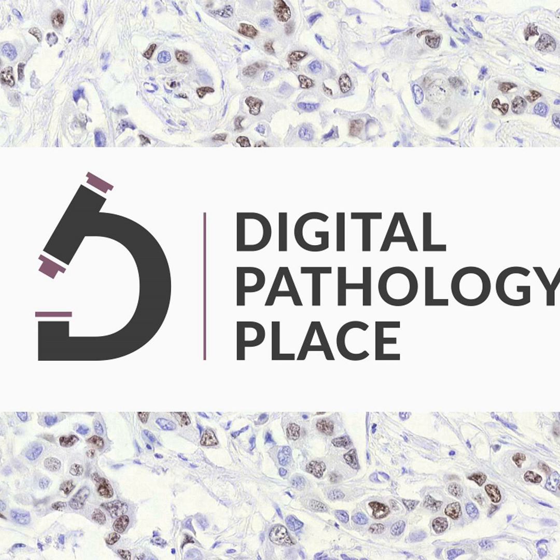This is in general something that I see in the biobanking, biomarker development workspace, because you often rely on purchased specimens. And me personally, with my own eyes, I have seen specimens that were paid for and didn't contain any of the tissue that was supposed to be there, or it was autolytic, all necrotic, useless basically.